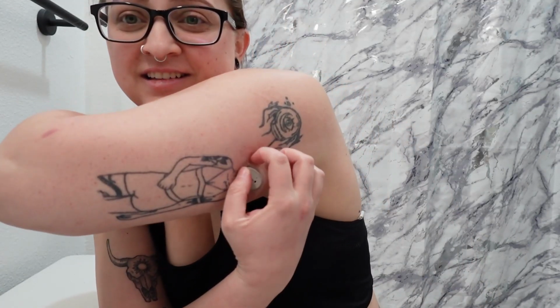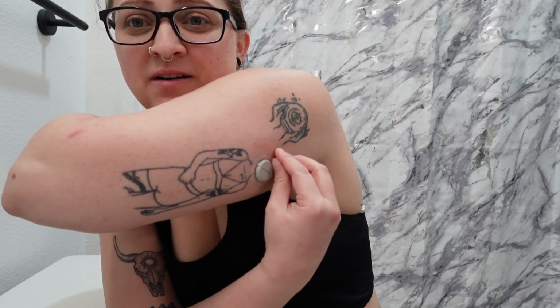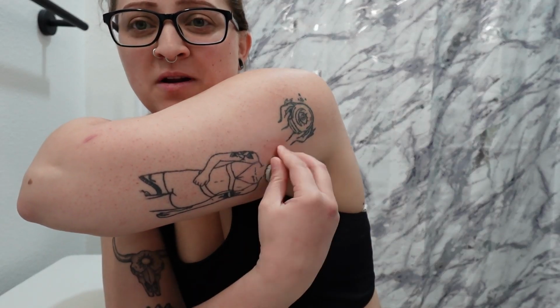Let's go ahead and do a double site change. We're gonna start with the Dexcom because she expired. Look at that. That is the Libre patch and the Dexcom patch glued together. Oh my goodness. Okay. Let's rip her off. Oh Lord. Oh, okay. Got it.